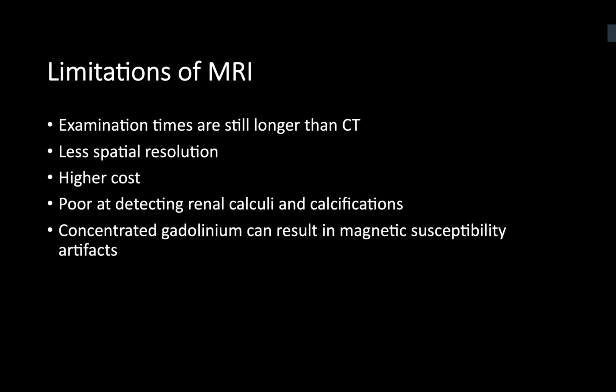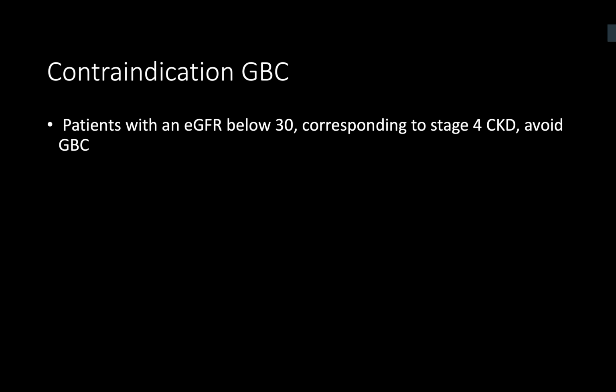So what are the limitations of MRI scan? So the limitations are mainly from artifacts described as noise. So if they've got, for instance, a hip replacement, or if the patient is not able to stay still, then this will create artifacts in the pictures and make it difficult to interpret. More so for prostate cancer, if, for instance, someone has a biopsy before the MRI scan, then this will create artifacts. And so the advice would then be to wait for about 6 to 8 weeks post-biopsy before they can have a reliable MRI scan. Well done.